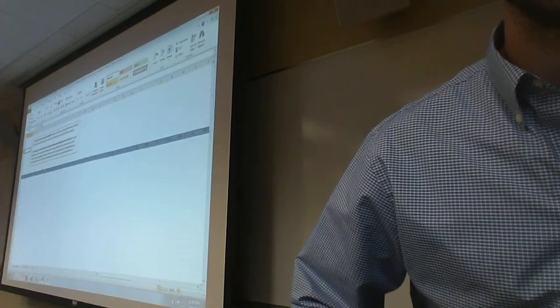So there's only two things you really need to do. It's basically one, paste in the raw voltage amplitudes. Tells you exactly where to paste it into. Okay. In this case, basically it's going to be down here. And then it's going to tell you that the normalized values are automatically calculated. So let's do exactly what we're talking about here. I'll give you a quick little overview of the sheet.